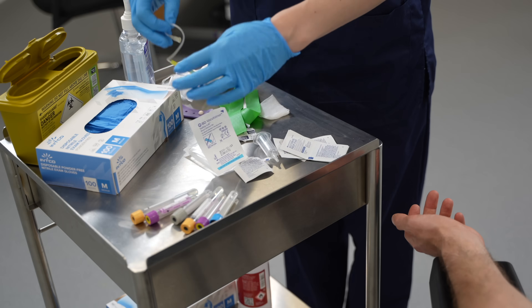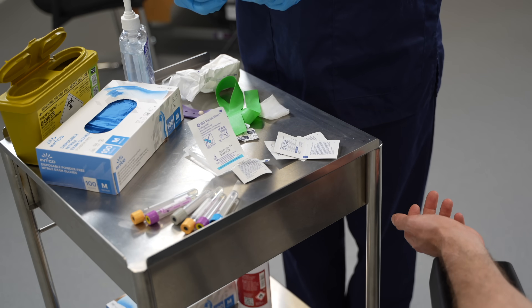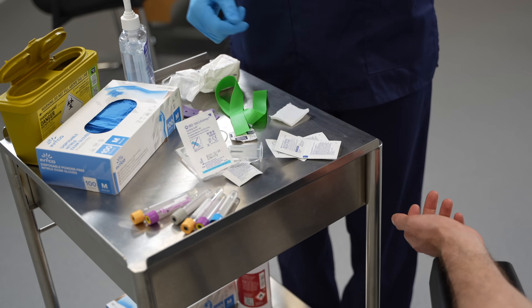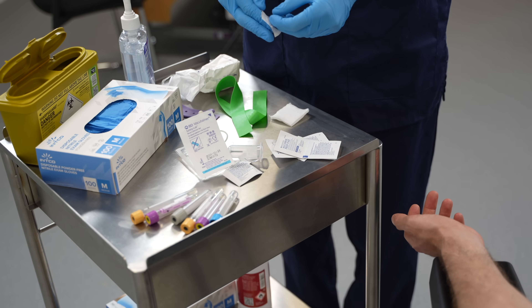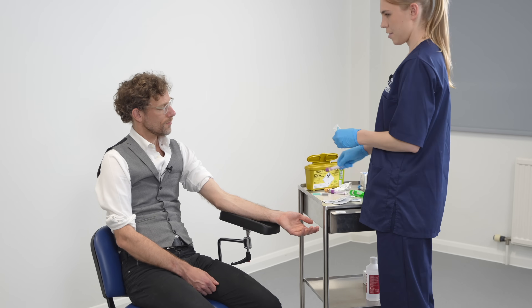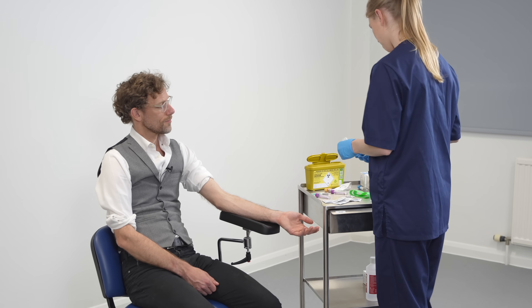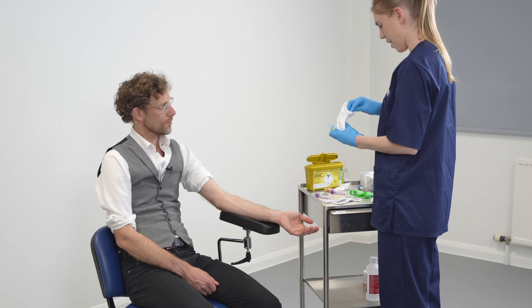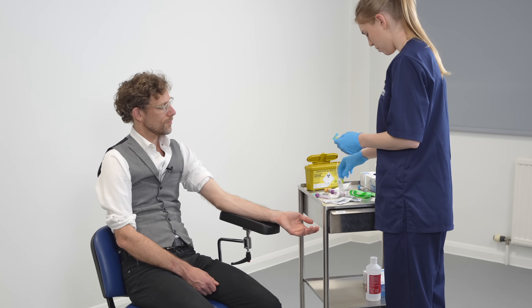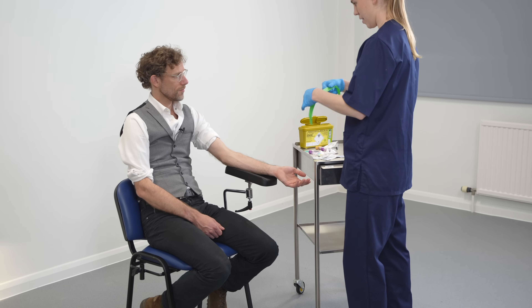This is where I take the needle — this is a butterfly needle — and I attach the vacutainer to it. I'll also get ready some gauze for when I take the needle out and get the plaster ready and open. At this point I also like to line up the containers in the correct order so I make sure they're not going to be mixed up. I prepare a cotton pad ready to put over the wound and open up the plaster a little bit to make it easier. Then I put the tourniquet back on.